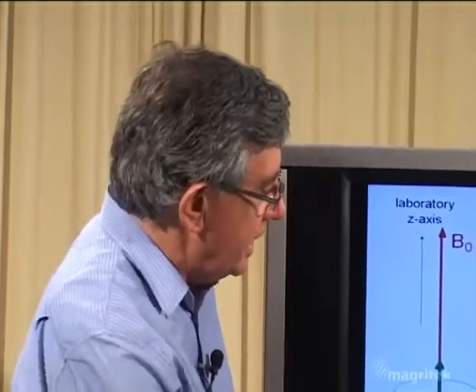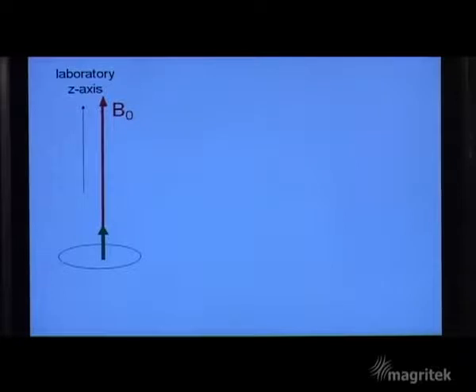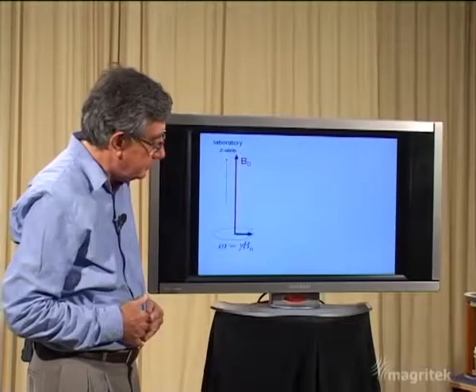In this video, we're going to be looking at the important ideas around spatial frequency, which are so important in understanding magnetic resonance imaging. To do that, we're going to use these slides here on the screen, and we're going to start at the beginning with a magnetic field and a magnetization vector for our atomic nuclei in thermal equilibrium. Of course, what we need to do to start the magnetic resonance experiment is to tip that magnetization vector away from equilibrium, which we do with the oscillating transverse magnetic field.